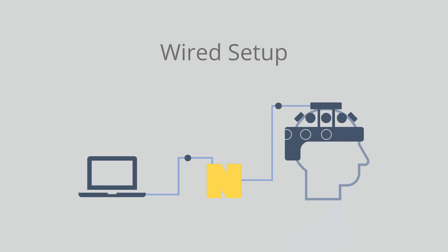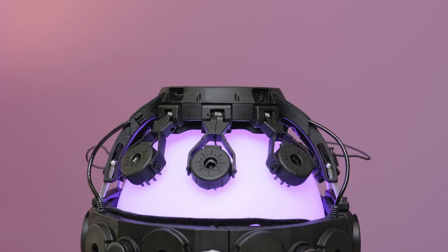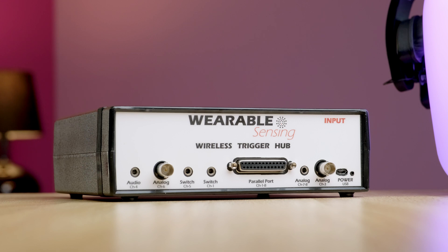This can be accomplished in either a wired or wireless fashion. For a wired setup, take your DSi trigger cable and connect the D-Sub25 connector to the MBTS, and the other side of the cable to the trigger input port on the back of the DSi-7. In case you have a DSi-24, the trigger input port is at the exact same location. For a wireless setup, we'll be using the wireless trigger hub. The wireless trigger hub is jam-packed with features which I won't be explaining in detail today, but if you're interested in a dedicated video on the wireless trigger hub, definitely let me know in the comment section below.